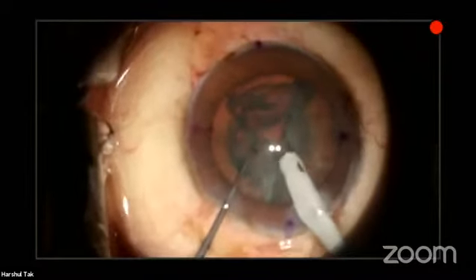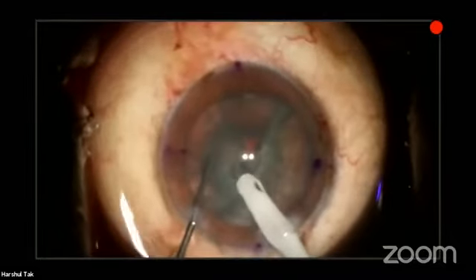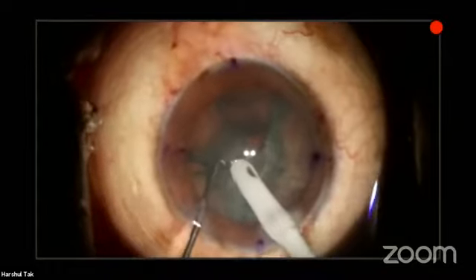So this is the Hartley phaco machine which I'm using. This is a 1.2 millimeter micro phaco tip which I routinely use for all grades of cataract.